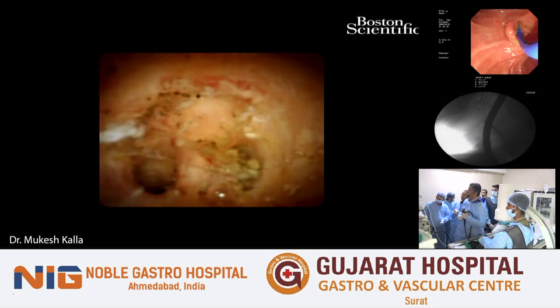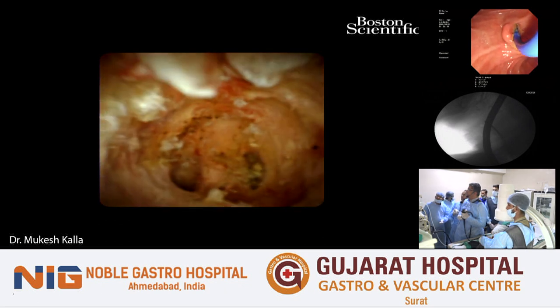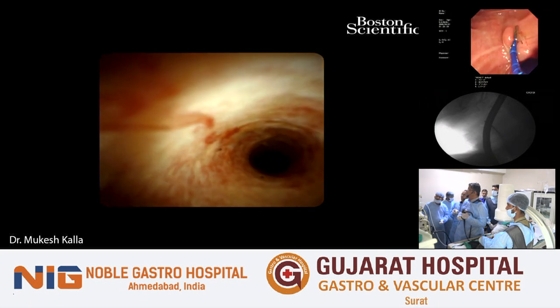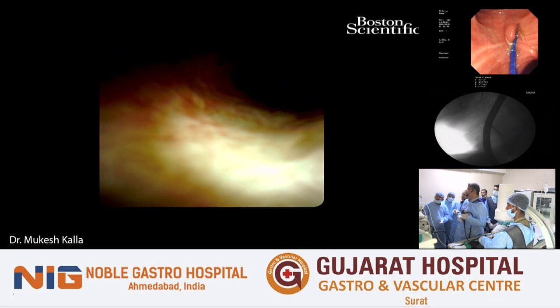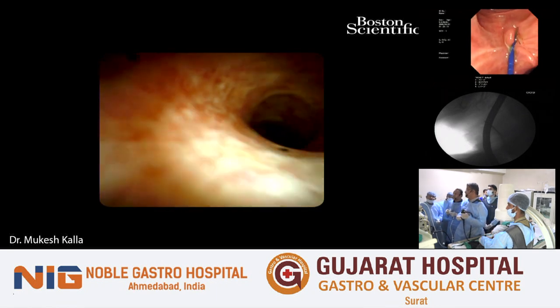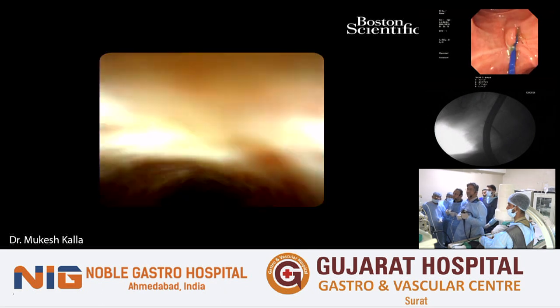Gradually we will come out. So there's the cystic duct opening, and we fall into the common bile duct then, which appears clear. Somil will help me to go beyond, this time not in the cystic duct, but above in the common bile duct.